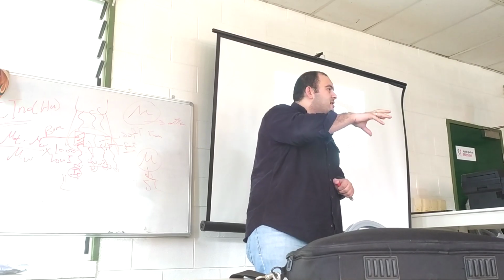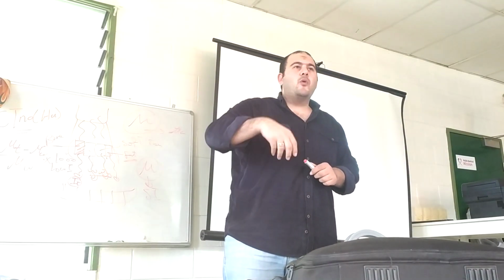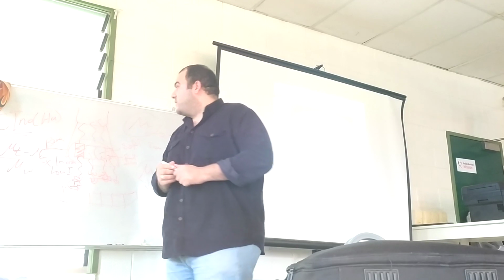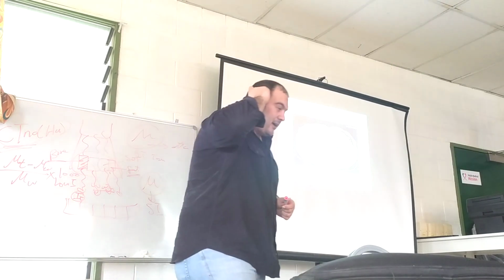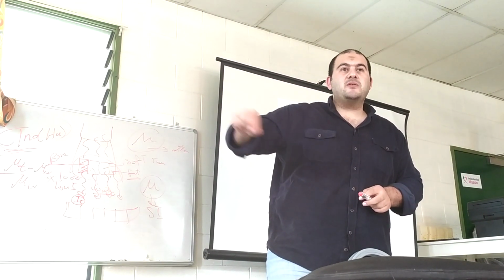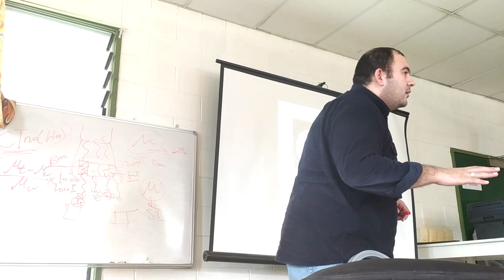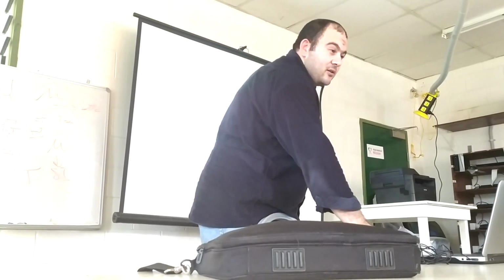Each pathology or tumor, if a tissue or tumor has fat content, you want to know the Hounsfield unit, because you want to know the composition of the tumor itself, whether it contains fat or doesn't. So it's very important to know the CT number. As clinicians reading reports, you will find this value. The radiologist indicates the CT number for renal stones or hemorrhage. Is it clear for you? Any questions? No questions? Okay.